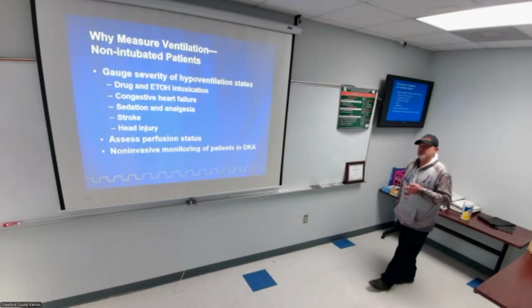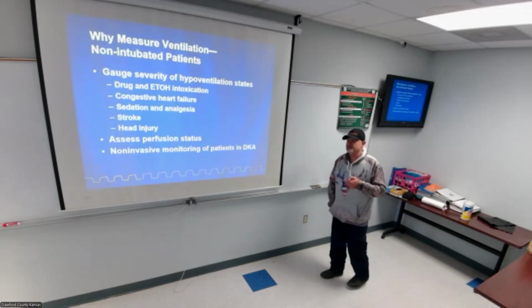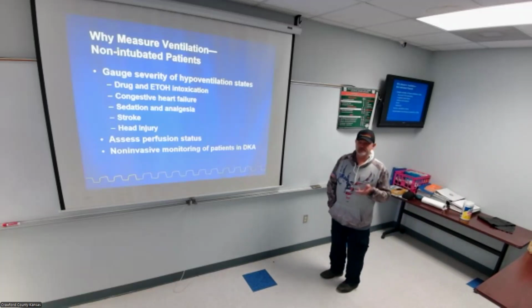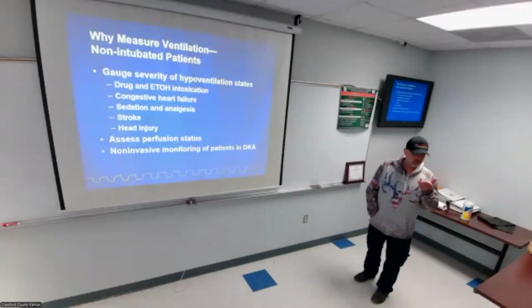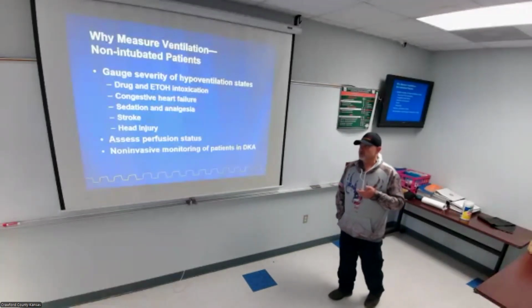Strokes, once again, it can go either way. If you have a stroke that's in the brainstem, they're going to be breathing really fast. If you have a stroke that's normal, the respiratory drive will slow down, their end-tidal CO2 will increase.